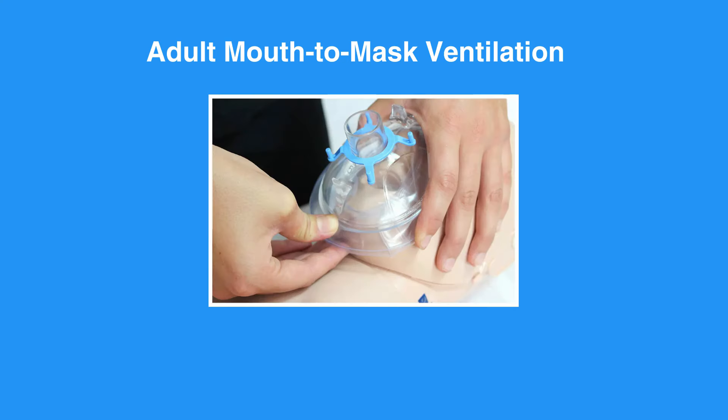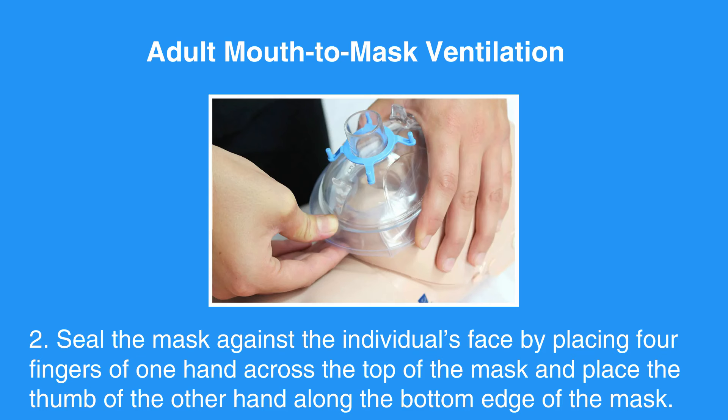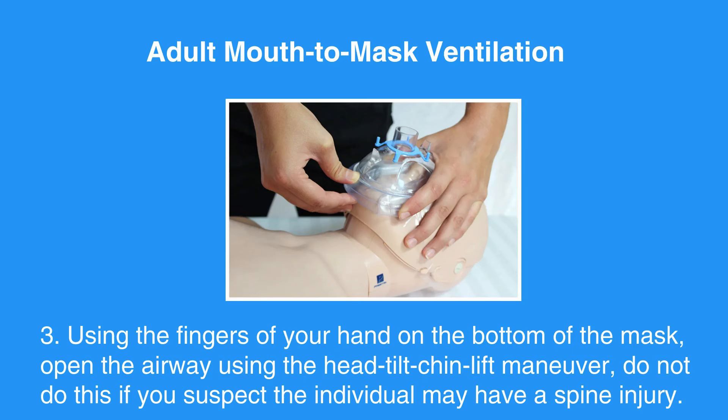Next, seal the mask against the individual's face by placing four fingers of one hand across the top of the mask and placing the thumb of the other hand along the bottom edge of the mask. Using the fingers of your hand on the bottom of the mask, open the airway using the head-tilt-chin lift maneuver.